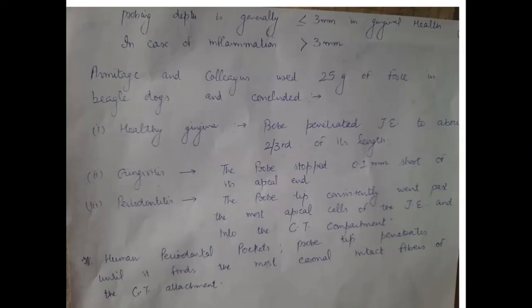In case of gingivitis, the same probe with 25 grams of force stopped 0.1 mm short of the apical end of the junctional epithelium. But when there was periodontitis, the same probe with the same force consistently went past the most apical cells of the junctional epithelium and went into the connective tissue compartment. It means that as the inflammation increases, the probe tip penetration goes deeper into the connective tissue.